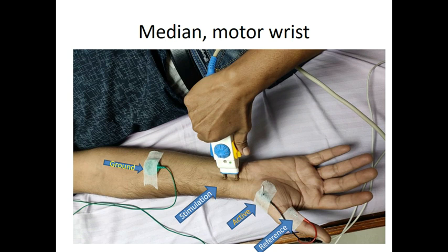Good morning. Today we will discuss the electrode placement of median motor nerve. The recording electrode is placed close to the motor point of APB, and the reference electrode is 3 centimeters distal at the first metacarpophalangeal joint. A supramaximal stimulation is given at the wrist and at the elbow for evaluation of the proximal segment of the median nerve.